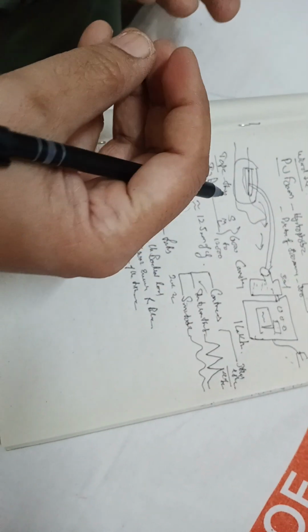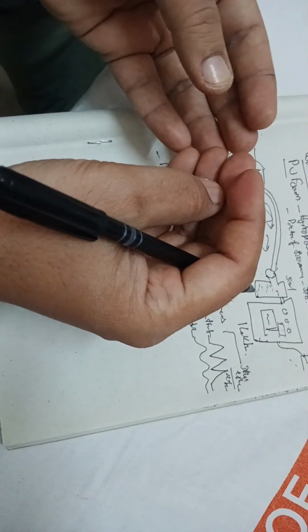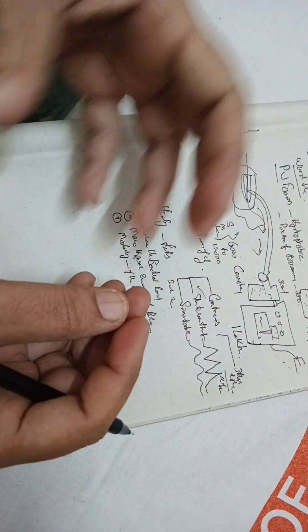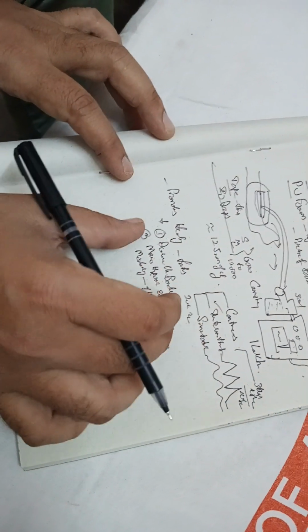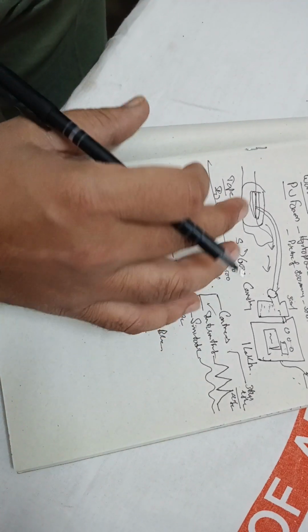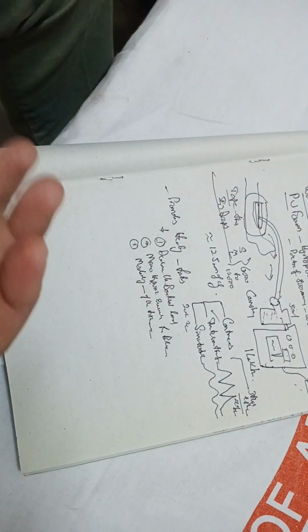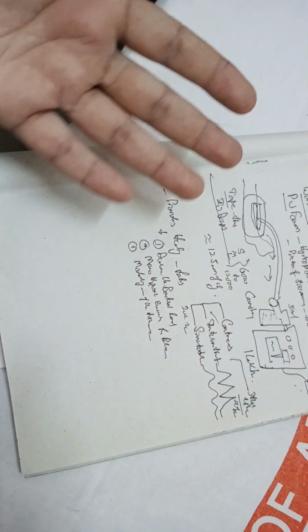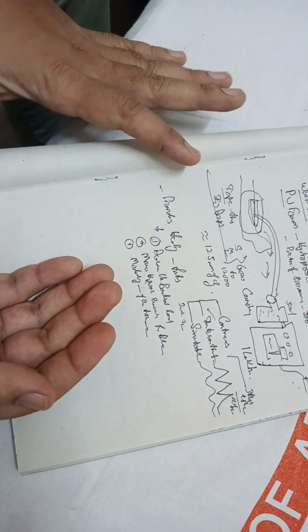Physically also it produces certain cellular level micro deformation they say. Physically also it helps in growth of the tissue. So all these factors, still there are n number of factors, but all those things promote the growth of the granulation tissue. So bacterial load is decreased and granulation is increased. That is what is our goal. So the healing happens faster.